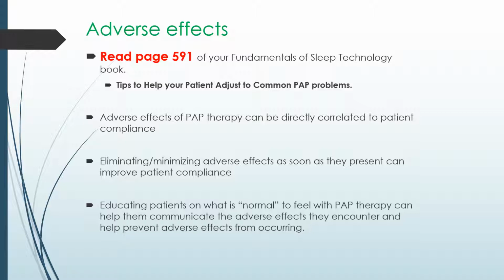So encourage them: I can only help you if you let me know what's bothering you. Tell me what you don't like about it, and let's see if we can find a solution together. And it could be a variety of things, but you have to make sure you open up that door and let them know it's their responsibility to let you know when they're having problems so you can help them. Let's go on to our next slide.